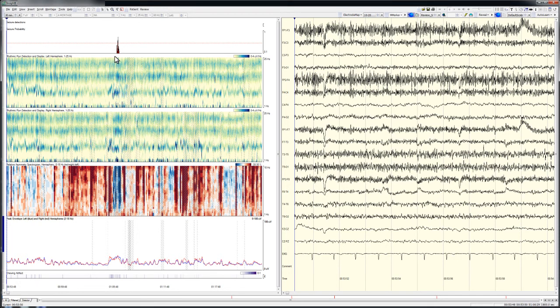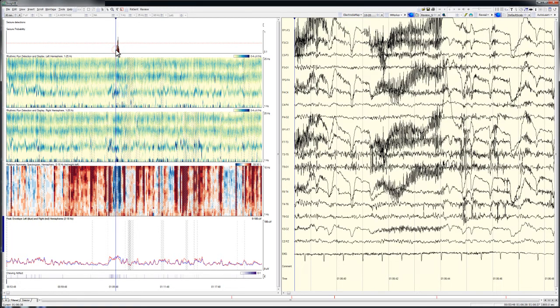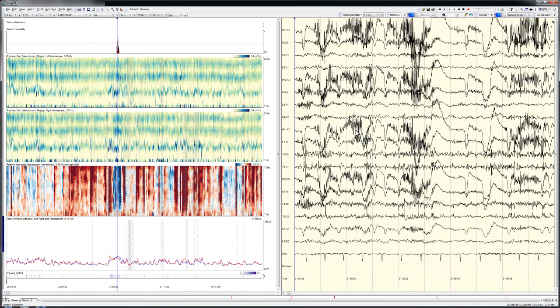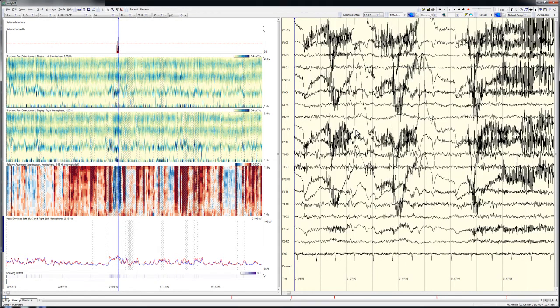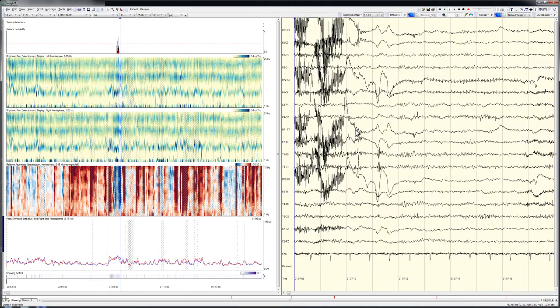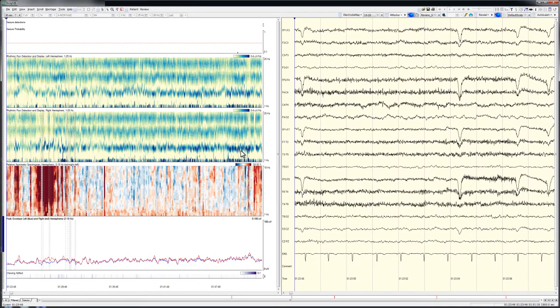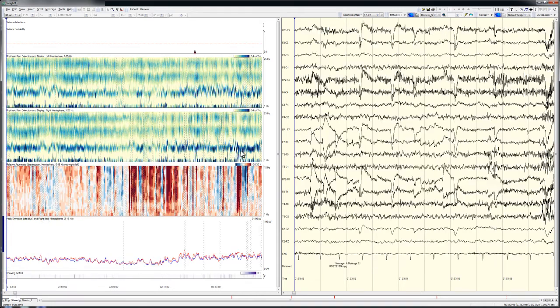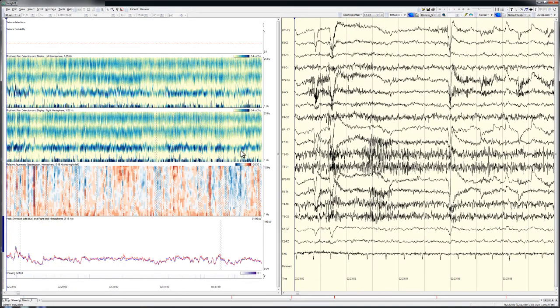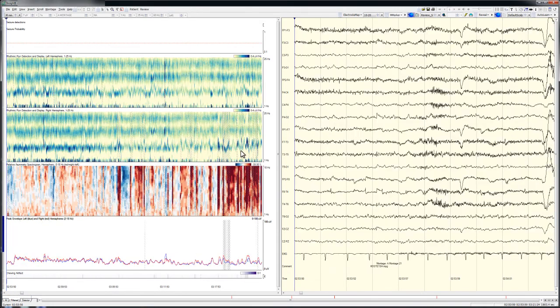Clicking on a small sub-threshold seizure probability peak in the first half hour of the recording shows only noise and artifact in the underlying EEG. Paging forward, typical background patterns and physiological patterns are evident, but nothing of interest is seen until about three hours into the record.